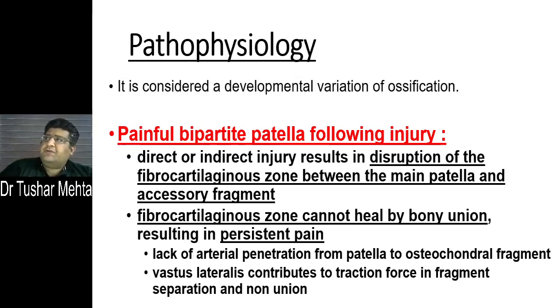I have already told you that bipartite patella is technically just a developmental variant where the ossification centers of the patella fail to fuse. Now, I told you there were two issues. One, as a student, it's a radiology spotter, so you are supposed to know about it. Two, you get confused on an X-ray whether it is a patella fracture or not. Now I'll tell you something more important about it.